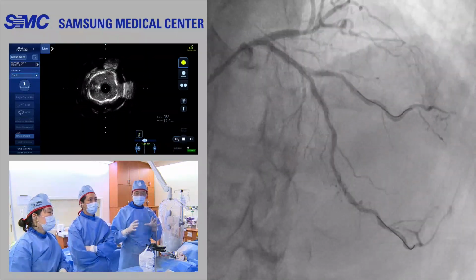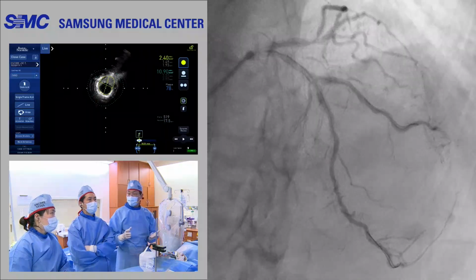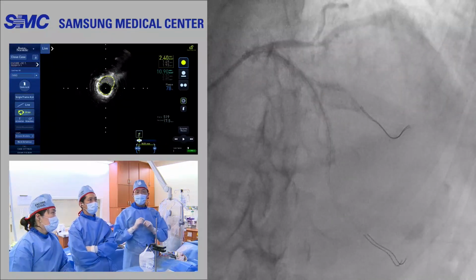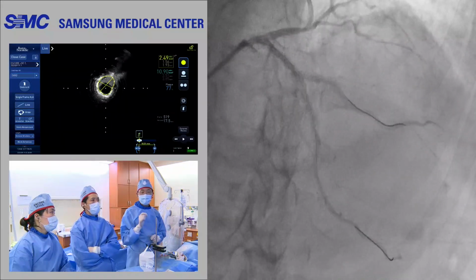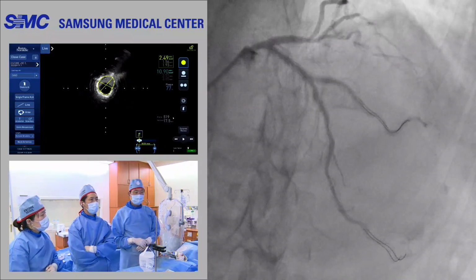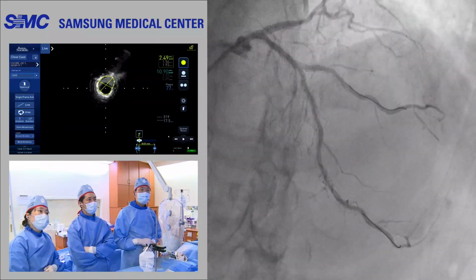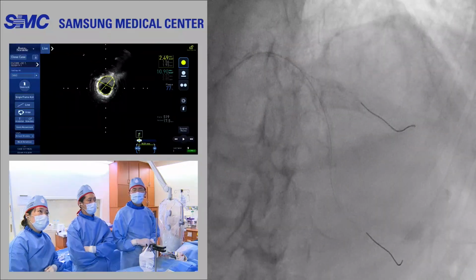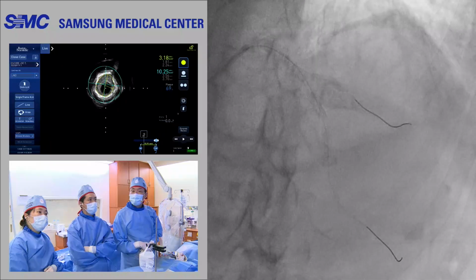There is a lot of discrepancy between FFR and IVUS MLA, MSA, because IVUS didn't consider the length. I believe that for a very, very short lesion, even the MLA is not of so great an impact. Do you think what is the residual stenosis about the LAD, just distal? LAD MLA? Residual diameter stenosis, your expectation?